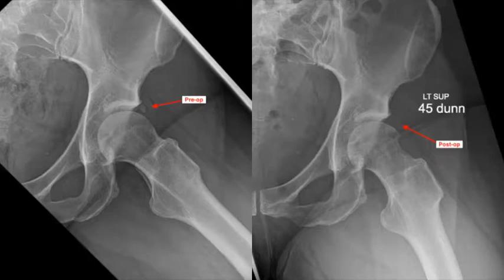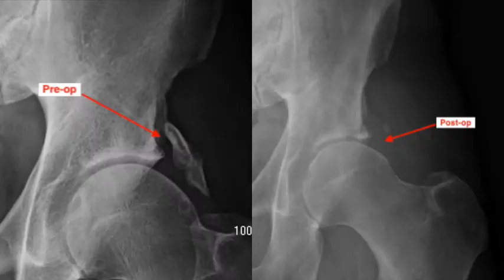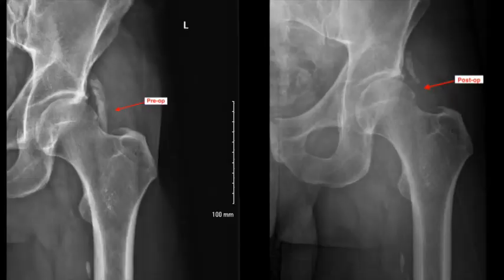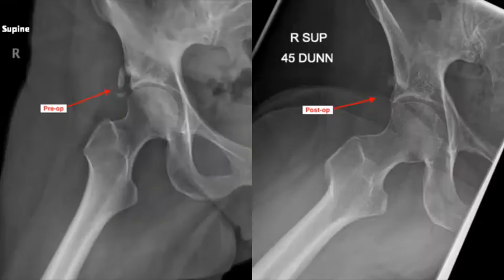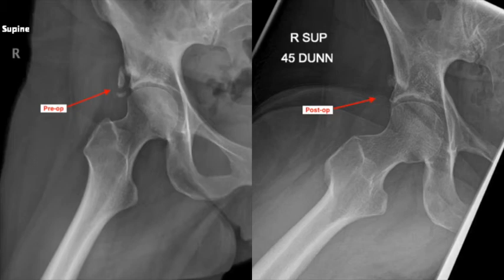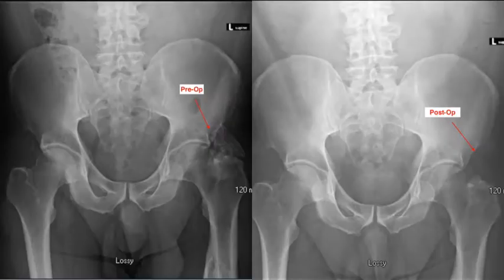The pre- and post-operative radiographs for each of the cases presented are demonstrated. It's important to note that in some cases, not all of the HO was removed. In cases where a small amount of residual HO remains but is in an impingement-free area, we felt it was not worth the additional soft tissue dissection to remove this bone.